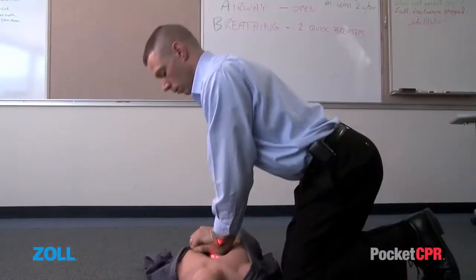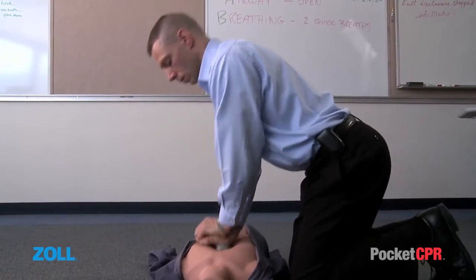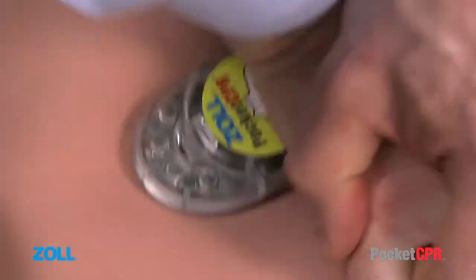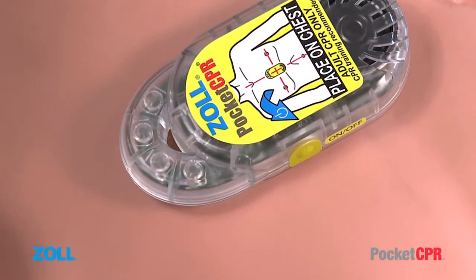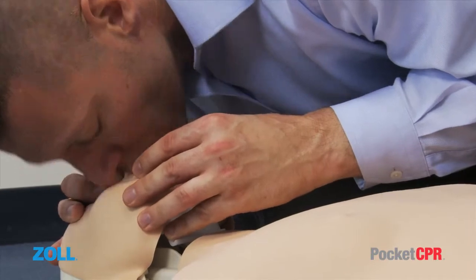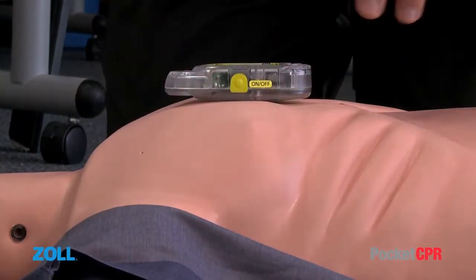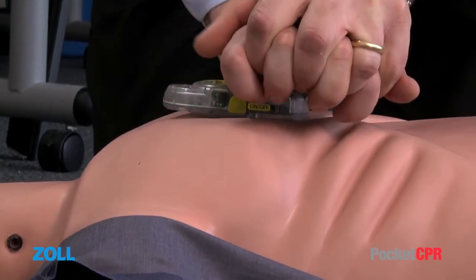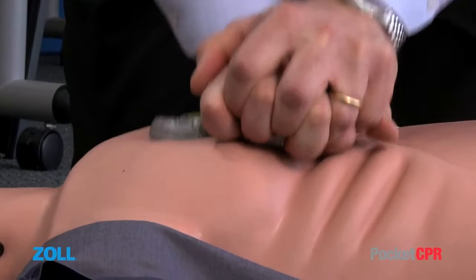After 18 seconds, and ideally 30 compressions, when performed at 100 per minute, the metronome will stop and the device will say, Open airway. Give 2 breaths. You'll have a brief pause to deliver 2 breaths, and then the metronome will begin again, urging you to restart compressions. Start CPR. Keep doing compressions and breaths until additional help arrives.